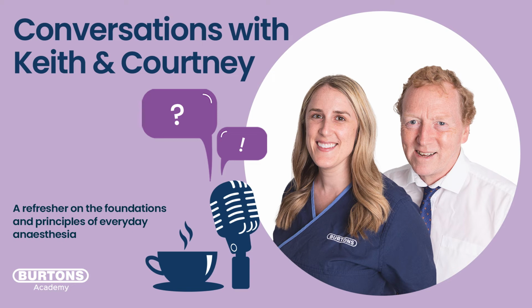So the character of our capnogram is beginning to tell us things like rebreathing possibilities. And this is probably another topic, dead space and rebreathing, but that rebreathing is as a consequence of inadequate gas flow. And that's a very, very different characteristic from rebreathing because of something like straightforward dead space. And I think that's probably a topic for another podcast.